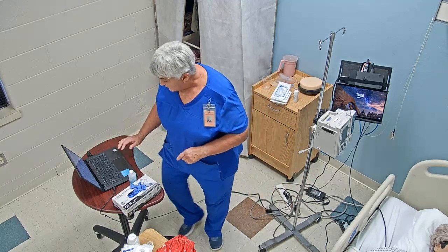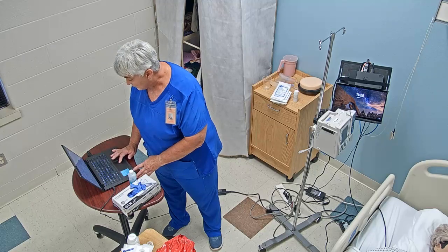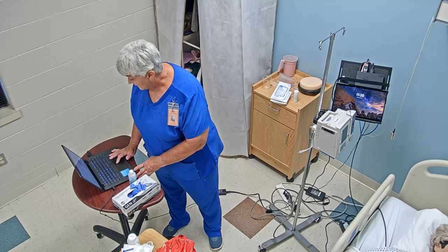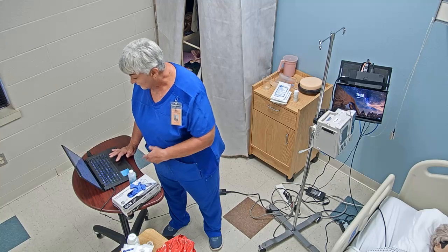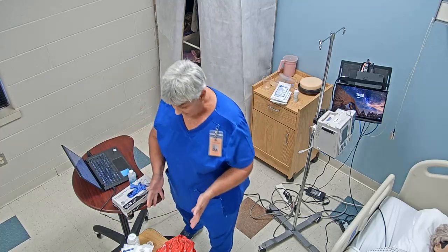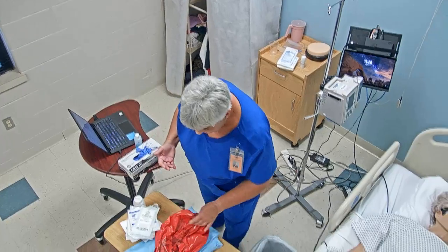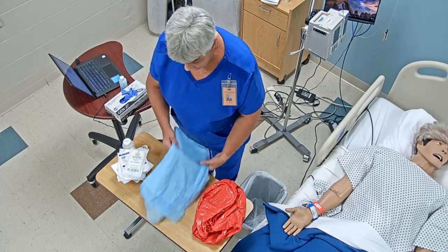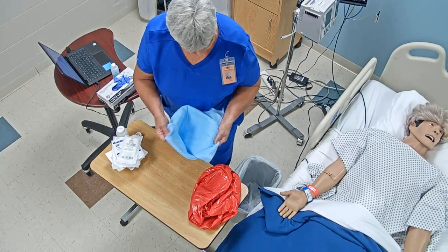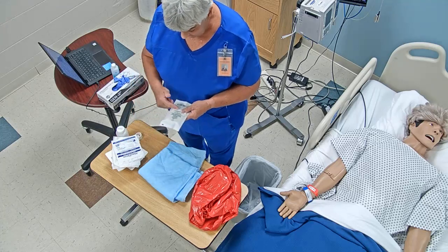Okay, so the other thing that we're going to be doing, I've checked my orders, and I'm just going to make sure that we are looking at what kind of dressing we need. Like I said, I've checked the chart, or the policy has told us what we're going to need. And so I need a biohazardous bag, I need a blue pad, which is an absorbent pad, and then I looked, we're going to need an ABD.